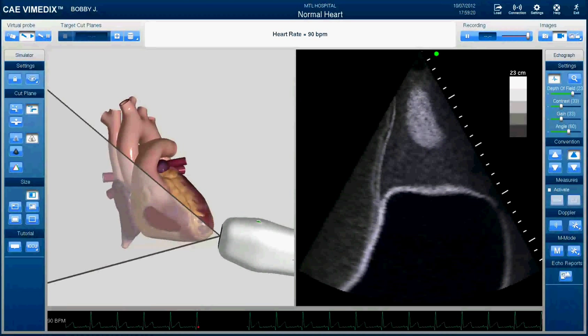This view that we see here — if you've watched the introductory video already, you'll recognize it as the view on the terminal screen on the simulator in the simulation lab. Over here on the left you'll see the augmented reality heart with the wand, and some of the simulator settings on the right.